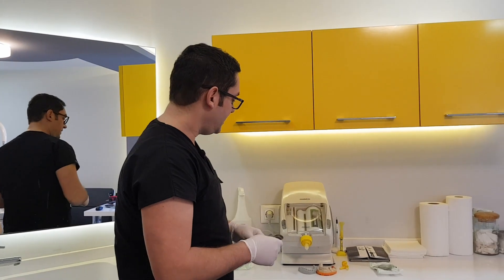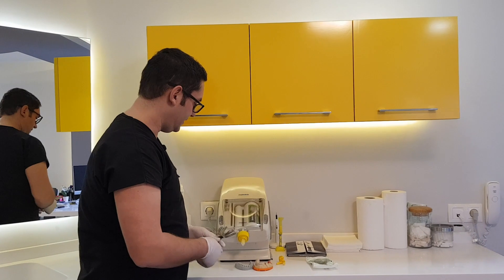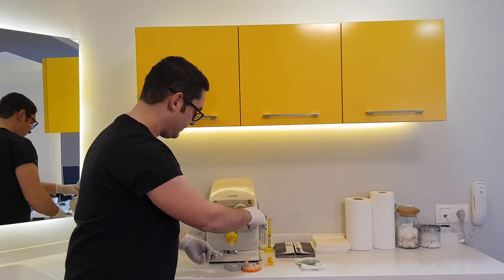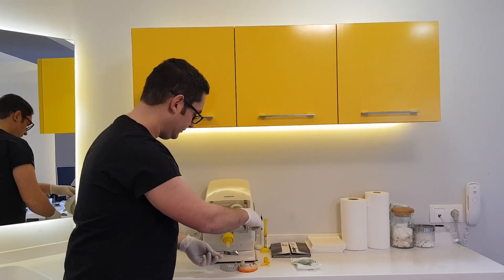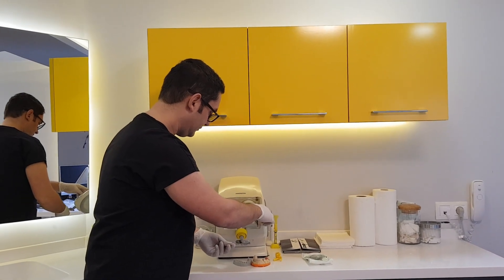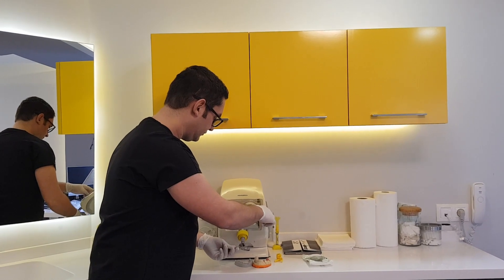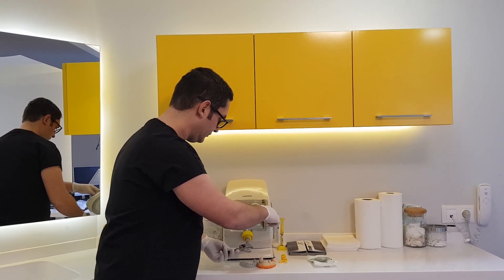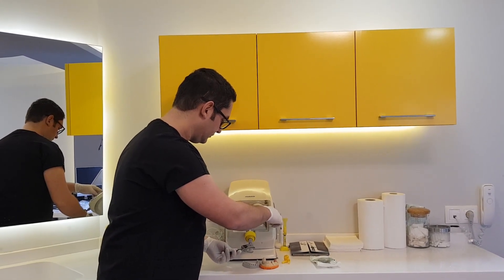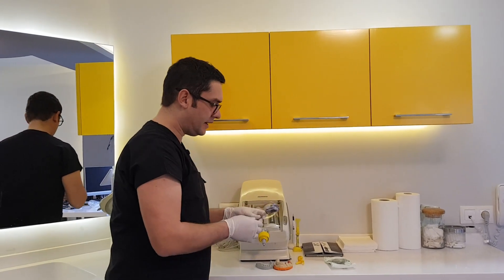This is the impression mixing machine. Now I am going to fill the tray with it. Now I am going to take the impression.